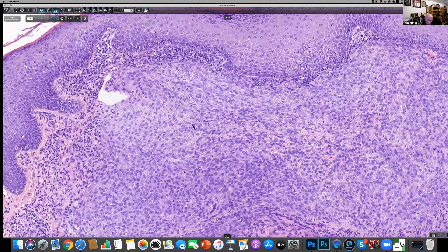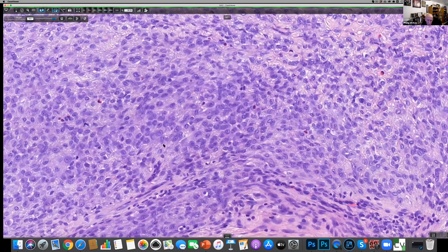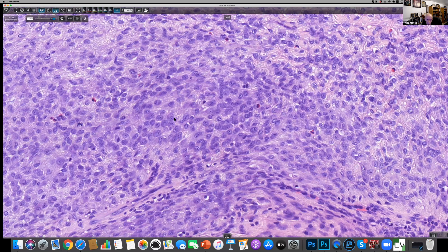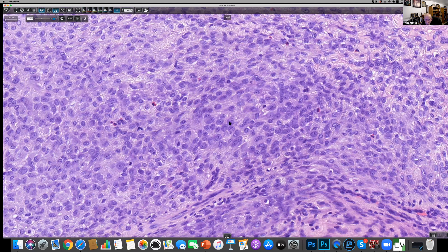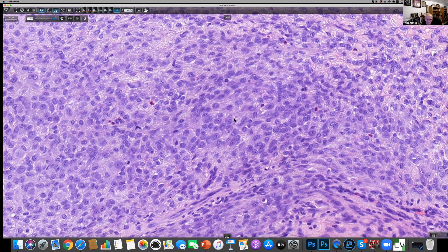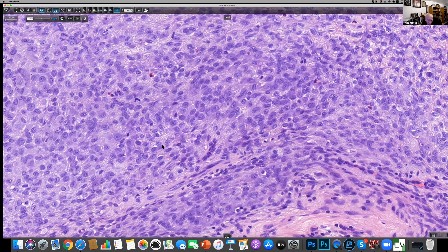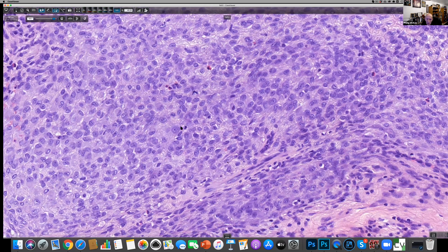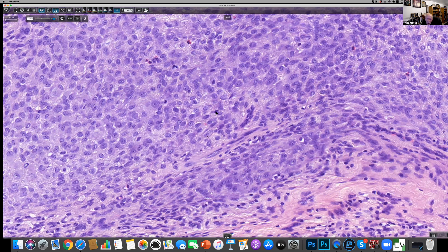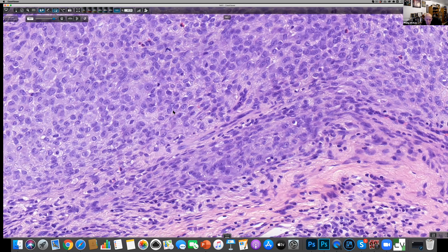Looking at the deeper portion, there are cells that are a little bit more plasmacytoid. There are some very nice cells right in the center where the cytoplasm is almost a little bit purple and the nucleus is eccentric. You could wonder about some plasmacytoid-like tumor, and a myoepithelioma would come into the differential — myoepithelioma being sort of like a mixed tumor without any of the glandular differentiation, so you're just looking at the stromal component.